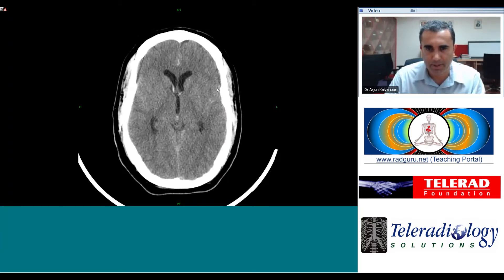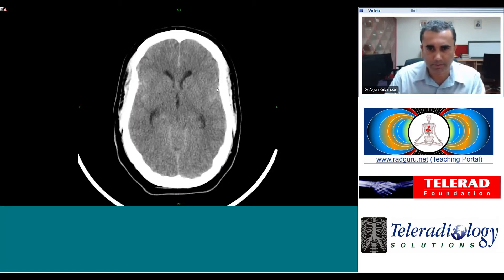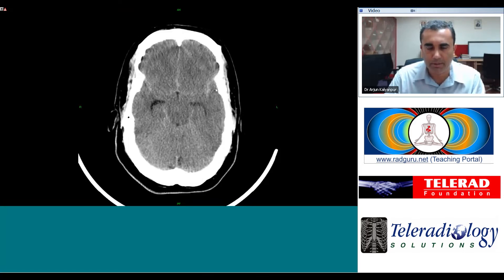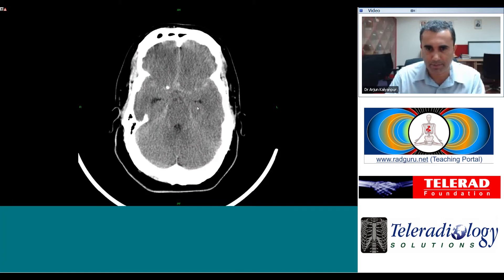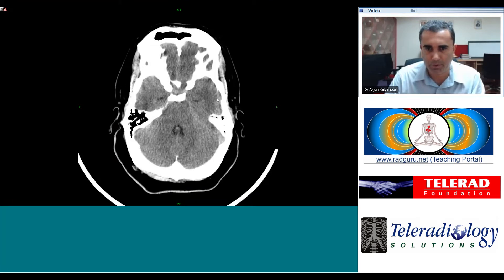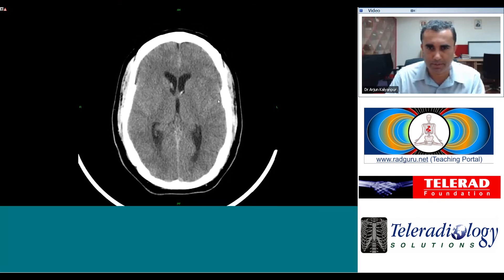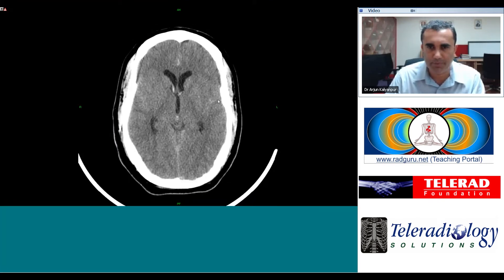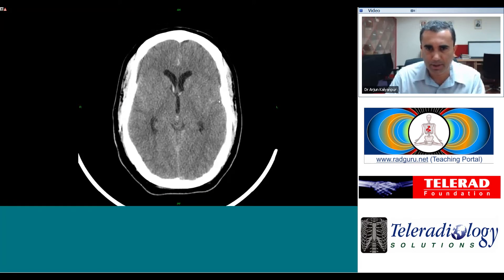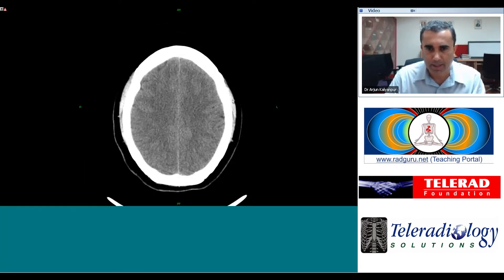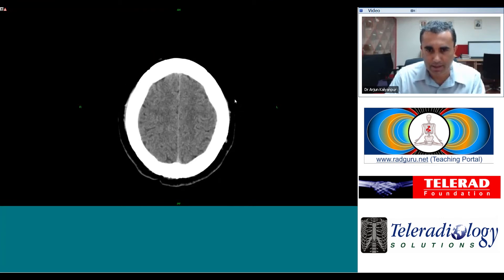The other relatively common midline aneurysm is the basilar artery tip aneurysm. We do not see one in the location of the basilar tip. So this is a ruptured anterior communicating artery aneurysm with subarachnoid hemorrhage resulting in communicating hydrocephalus.